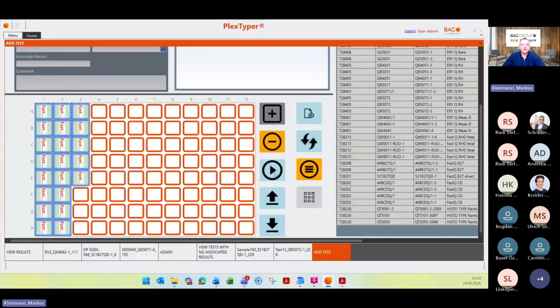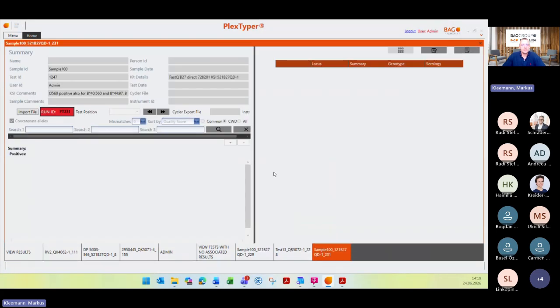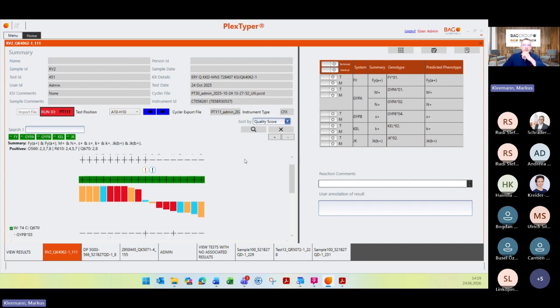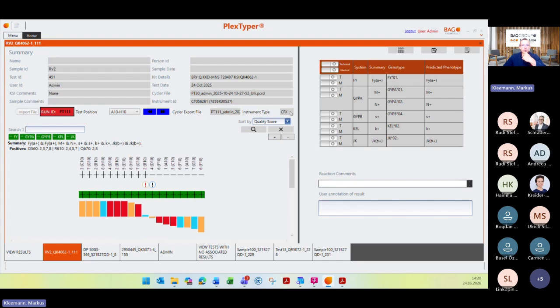So the next step will be that you just click this play button. I think you already know this, and import your raw data file. But I want to go into more detail on different results. I think I will start with this one here. So this one was a KKD MNS kit file or run. And what we find here, I think you know this window, but I just want to go over this.